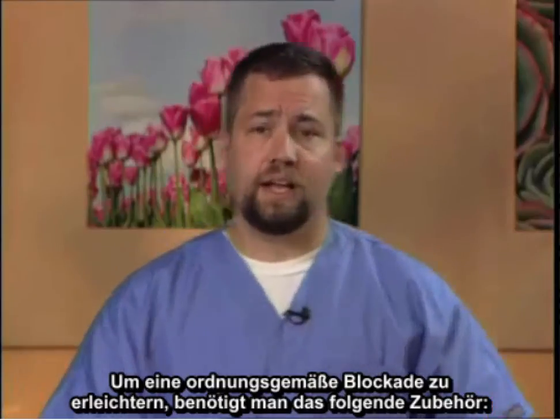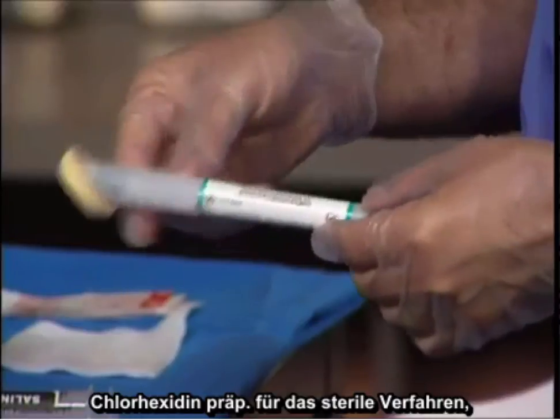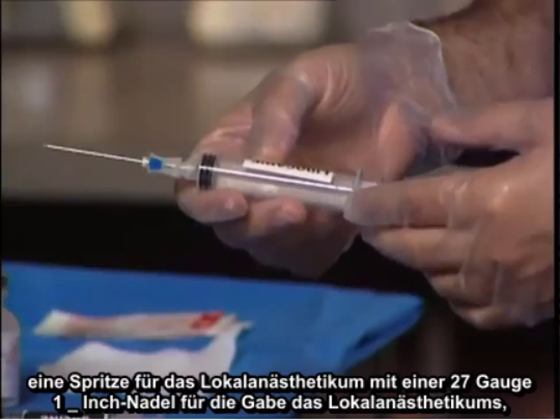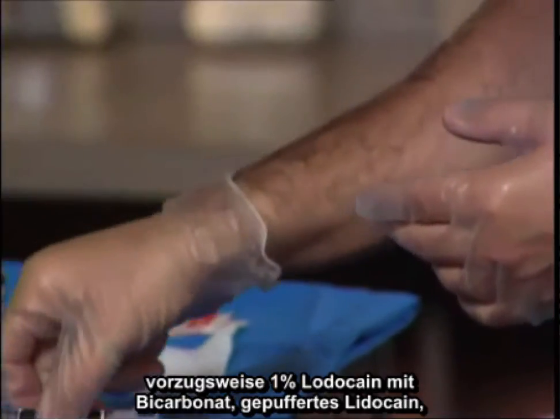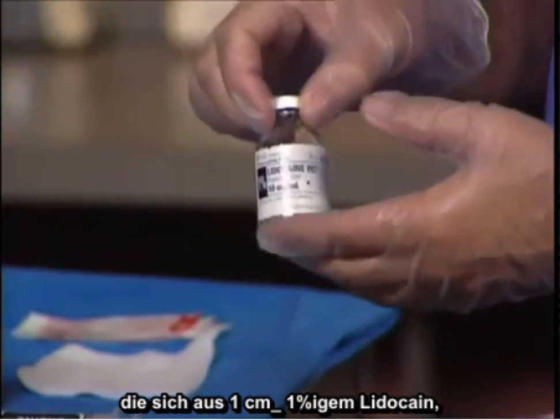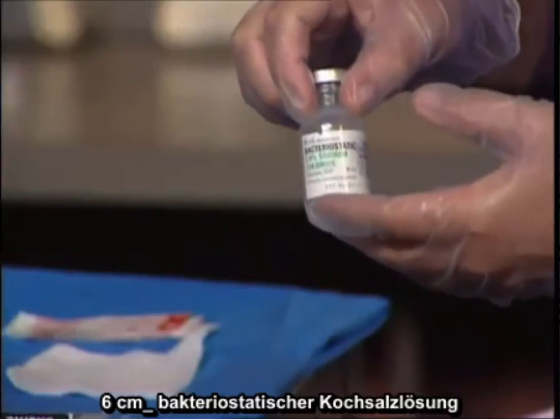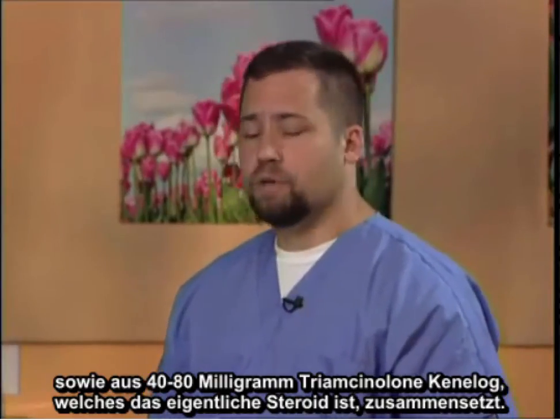In order to facilitate a proper block, the following equipment is required: a chlorhexidine prep for sterile technique, a local anesthetic syringe with a 27 gauge 1.5 inch needle for local anesthetic placement, preferably 1% bicarbonated lidocaine, buffered lidocaine, a syringe containing the epidural steroid mix, which is composed of 1% 1 cc lidocaine, 6 cc's of bacteriostatic saline, and then 40 to 80 milligrams of triamcinolone Kenalog, which is a particulate steroid.